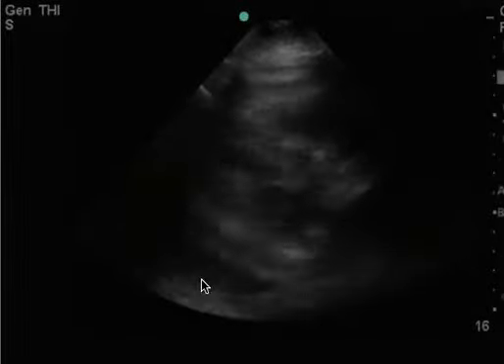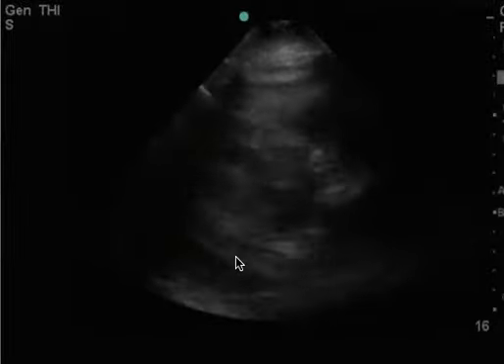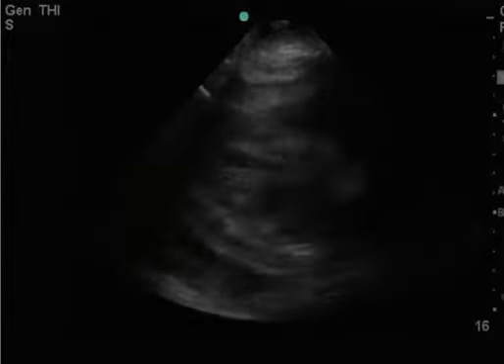This is a cardiac ultrasound. You can see here there's a clear pleural effusion, but there also appears to be a pericardial effusion — this sliver here. It would help to get a better view of the descending aorta, which you do see briefly right here, and to have the depth increased slightly.